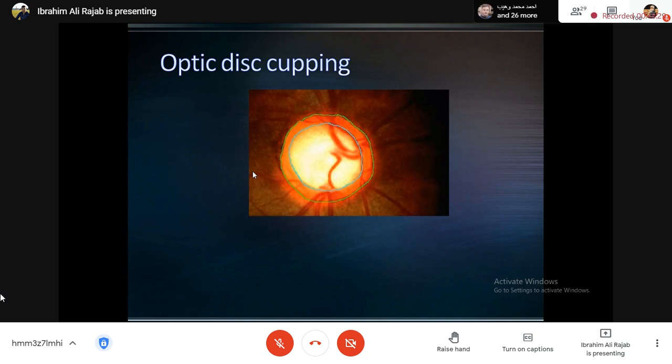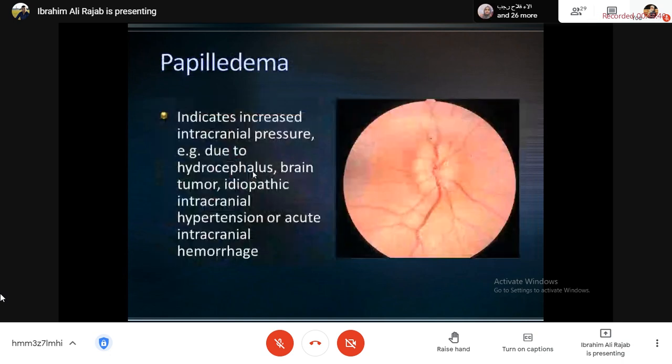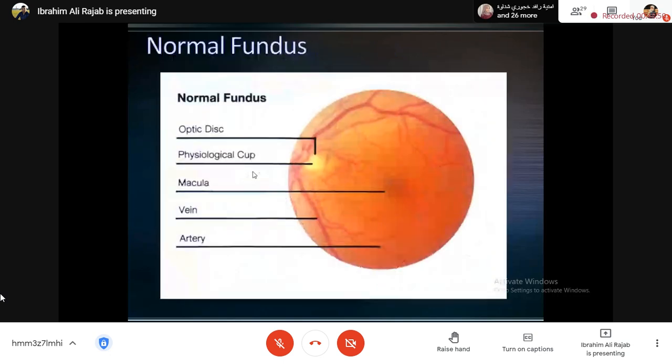دكتور، هنا تقريبا نورمال، يعني 30. خليني أنا راح أطلع لك صورة، ما يخالف. راح أطلع لك مثلا هاي الصورة. هذه الصورة بتشوفين الأوبتيك ديسك كاب، تشوفيه هو هذا السنترال اريا اللي لونها صاير أصفر، وحولها أكو نيوروريتينال ريم. أوكي، هاي السايز مالتها.